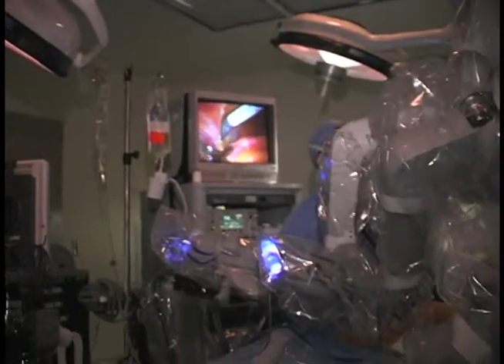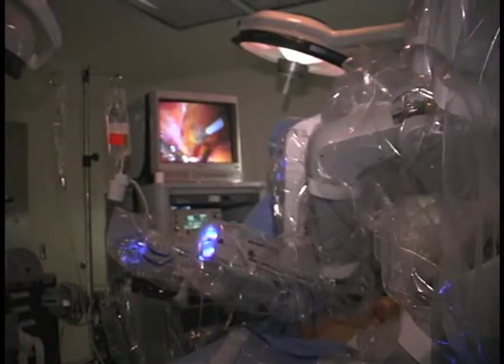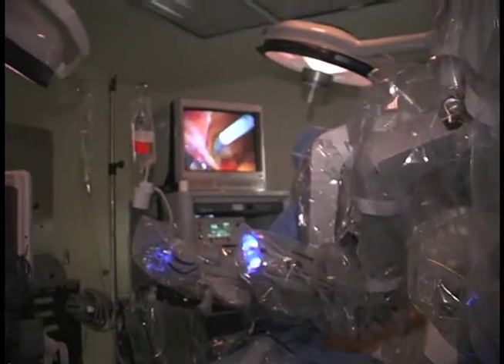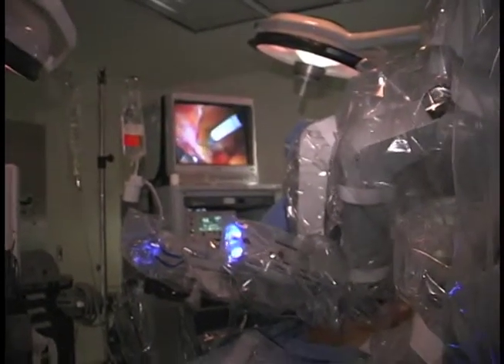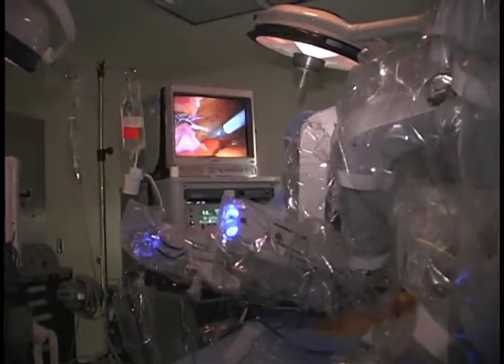Each instrument is designed to mimic the motions of the human wrist. It's not quite as versatile as the human wrist, but it comes close.